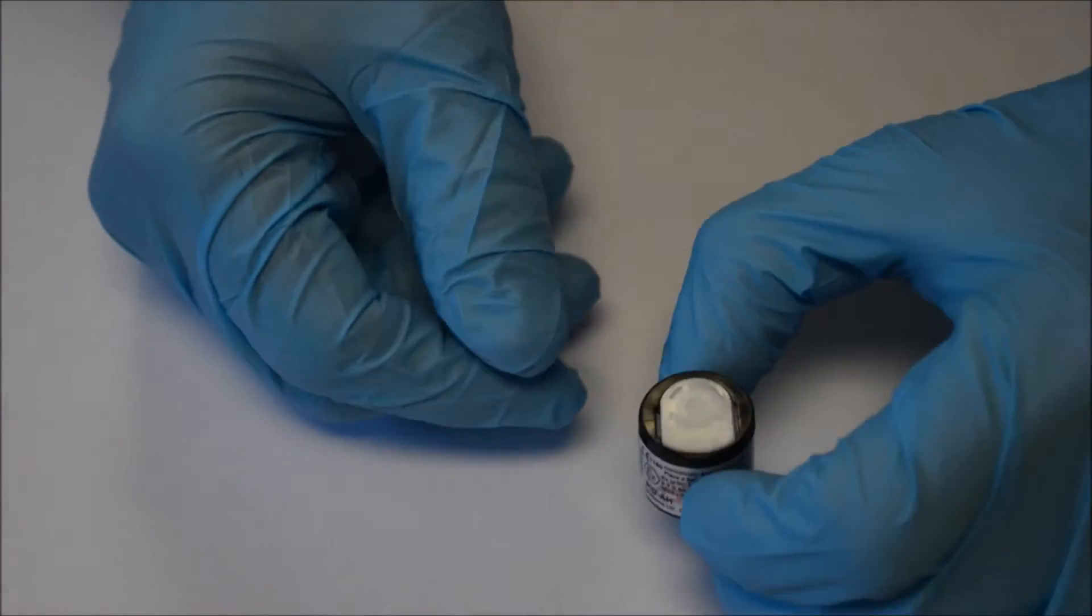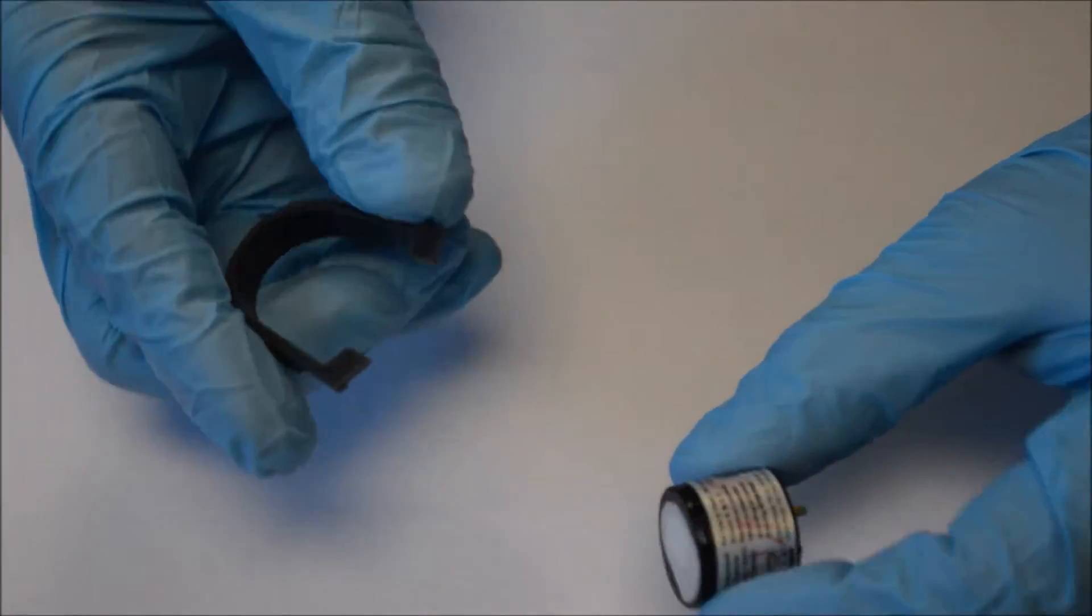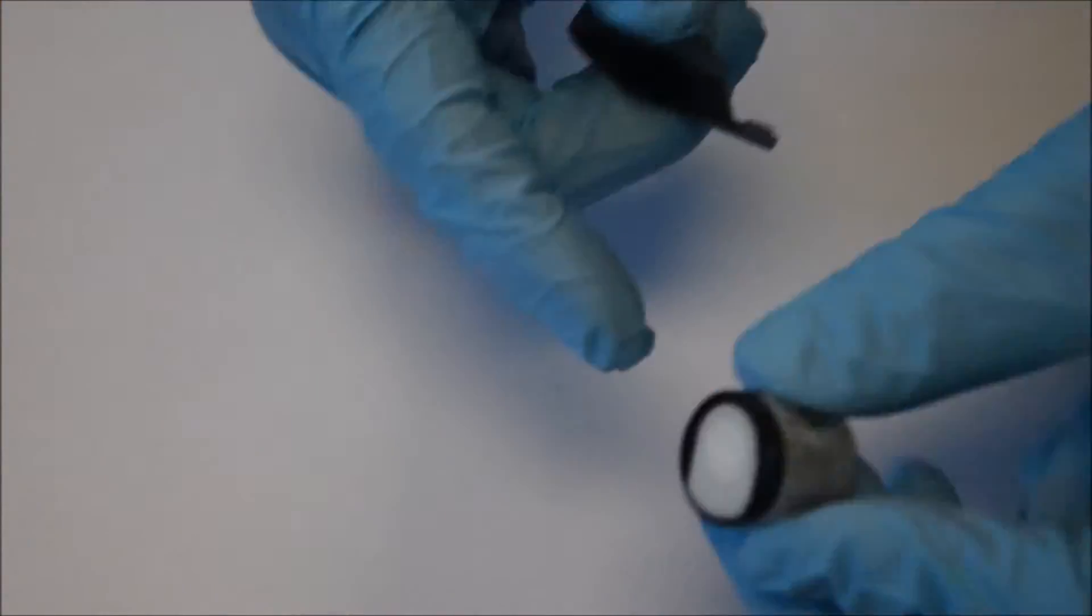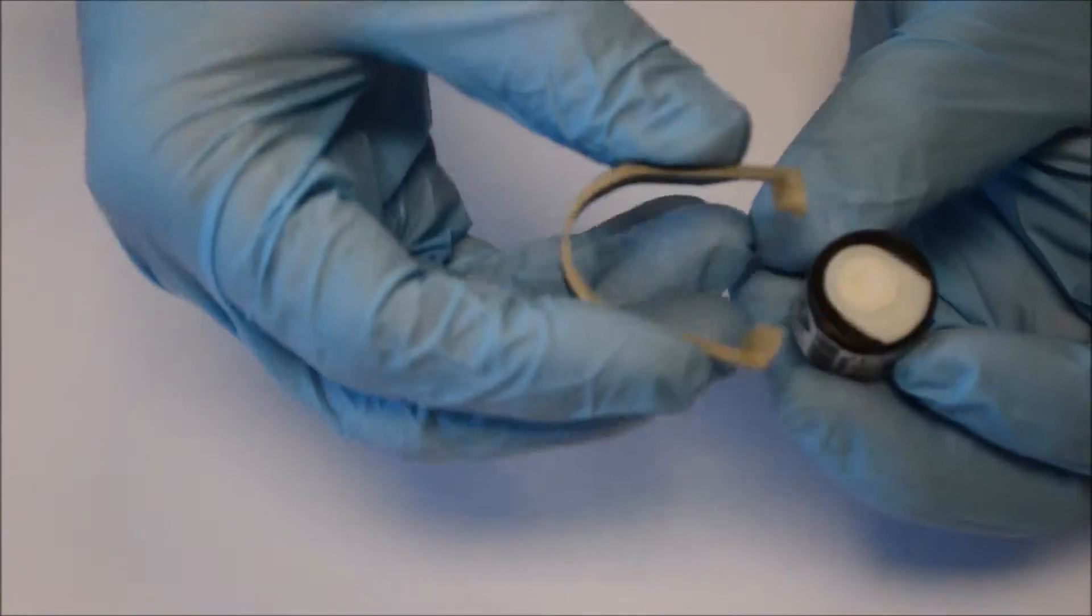First of all we need to remove the electrode stack which is this white section in the top of the cell. How we do that is if you notice there's a slot on either side which relates to the slots on the tool.